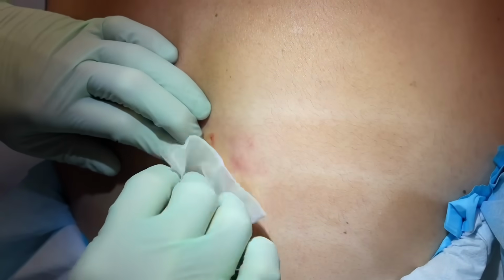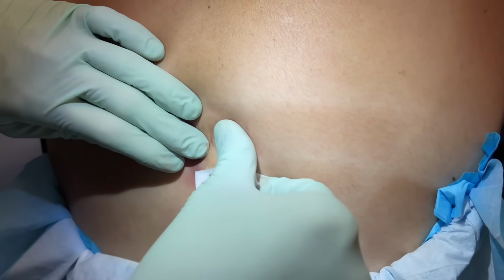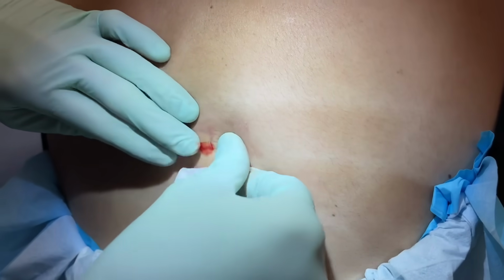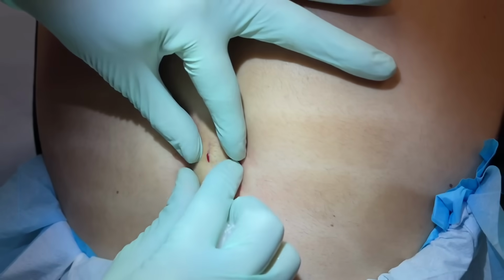So we'll let you heal now for like 2 weeks with this, and then we'll do a 2-week follow-up. And I'm just going to put a little compression bandage on just for today, and then just a little Band-Aid for 2 or 3 days as that little cut heals. We just did a small cut right at the bottom of your scar there.